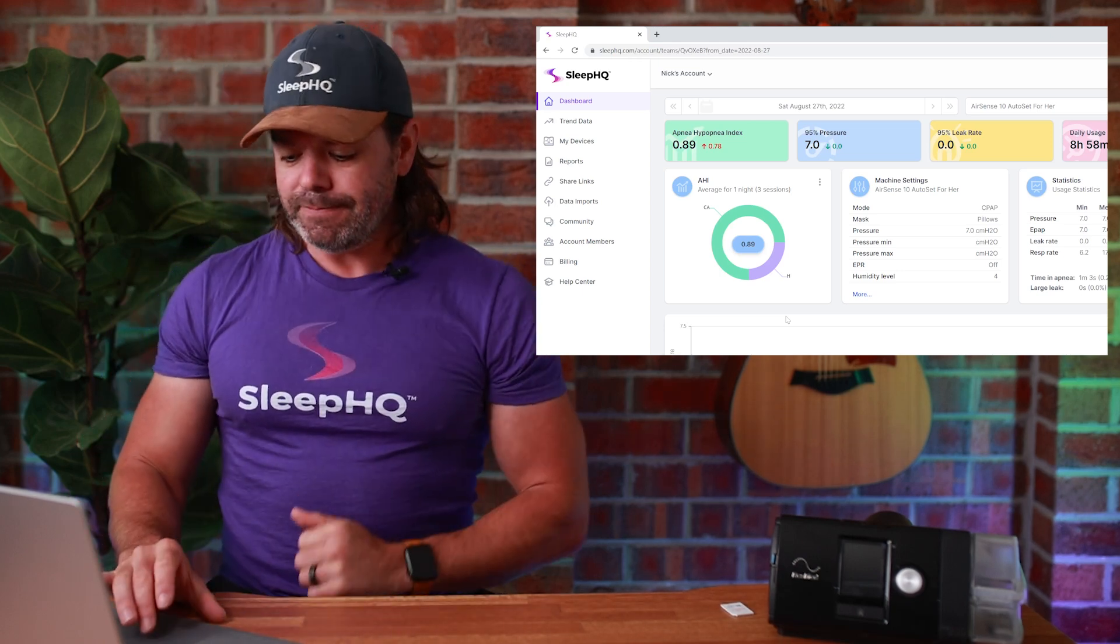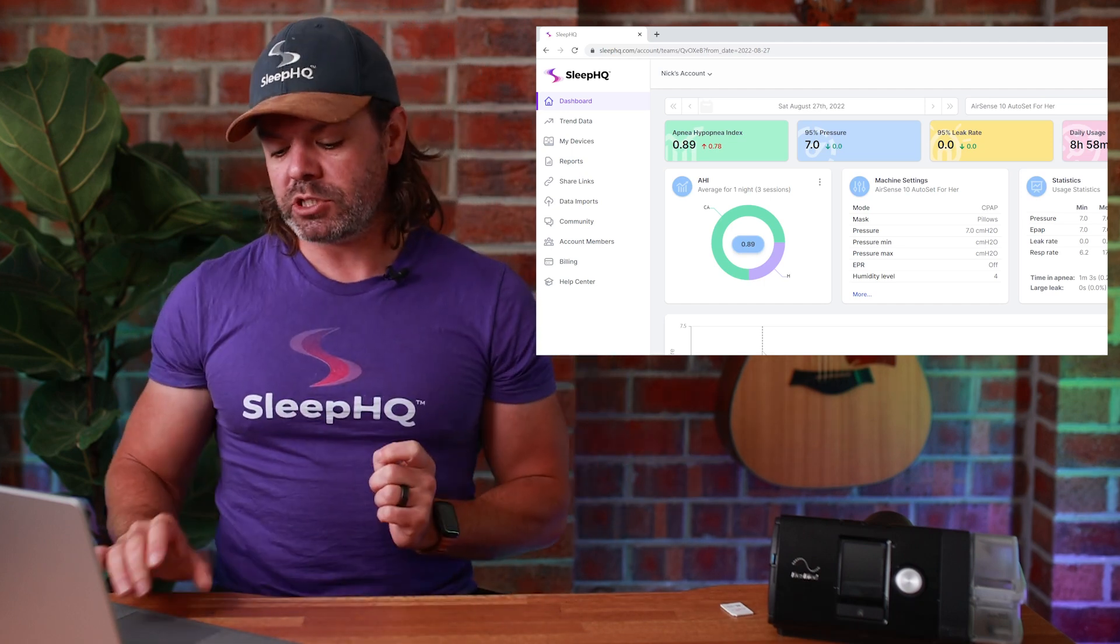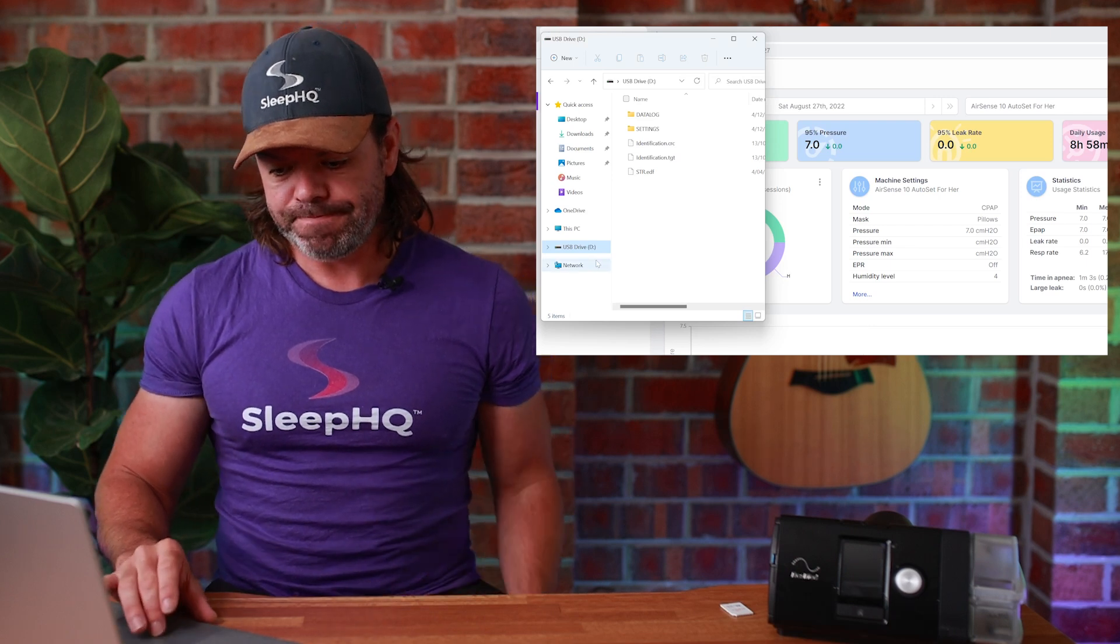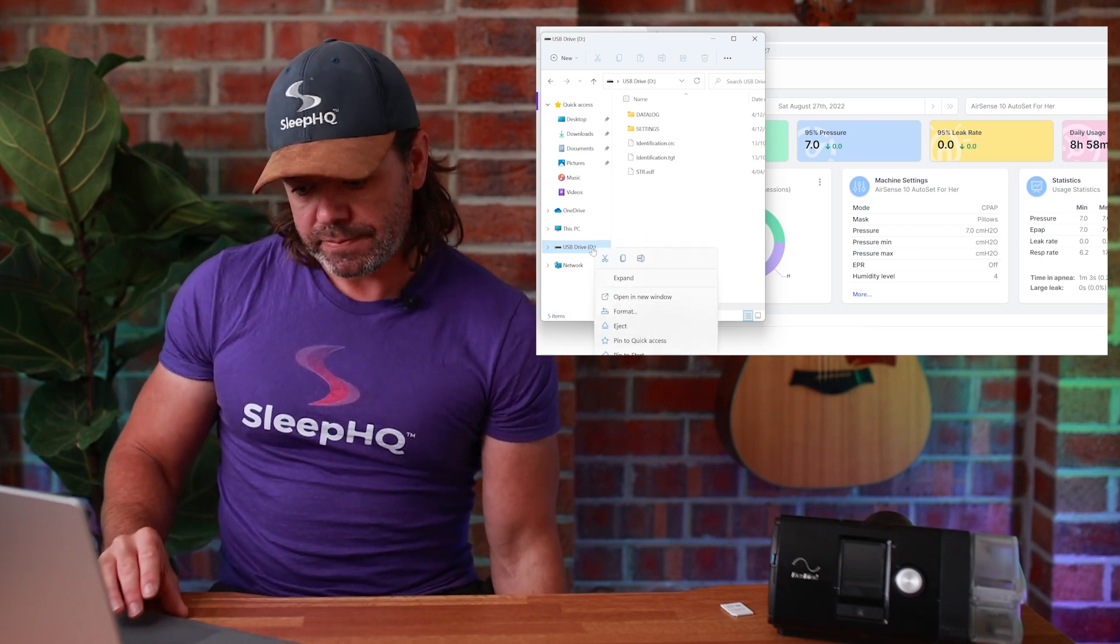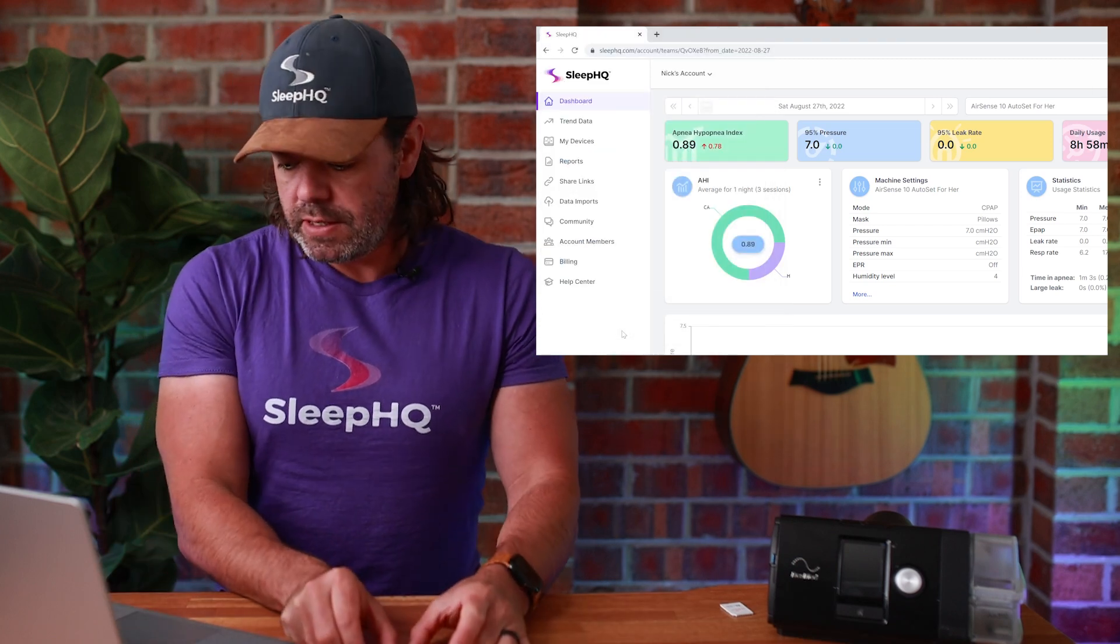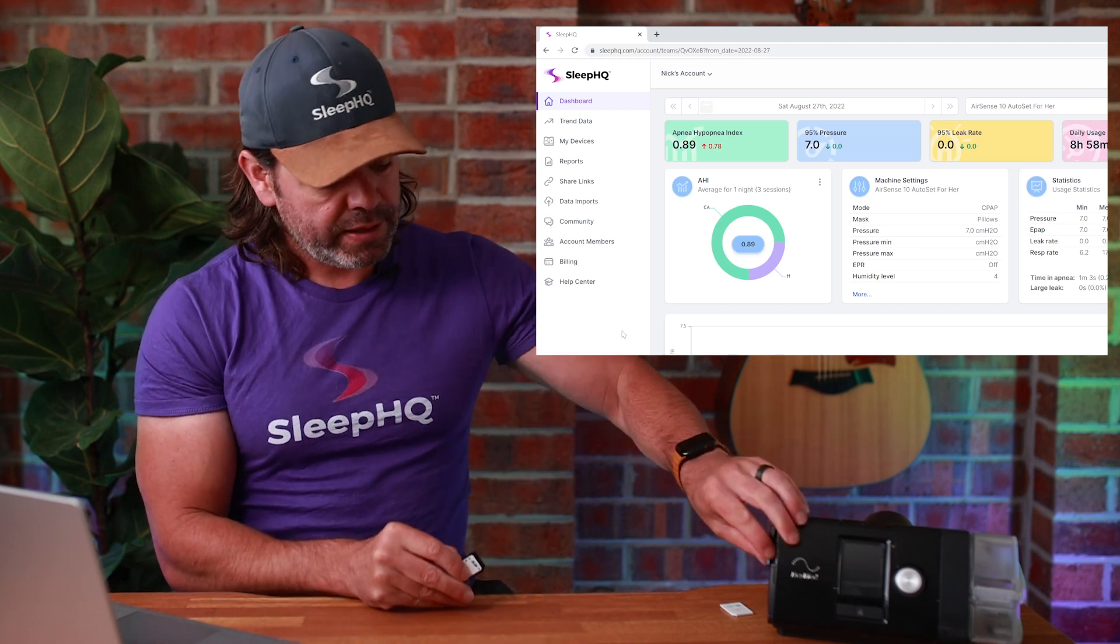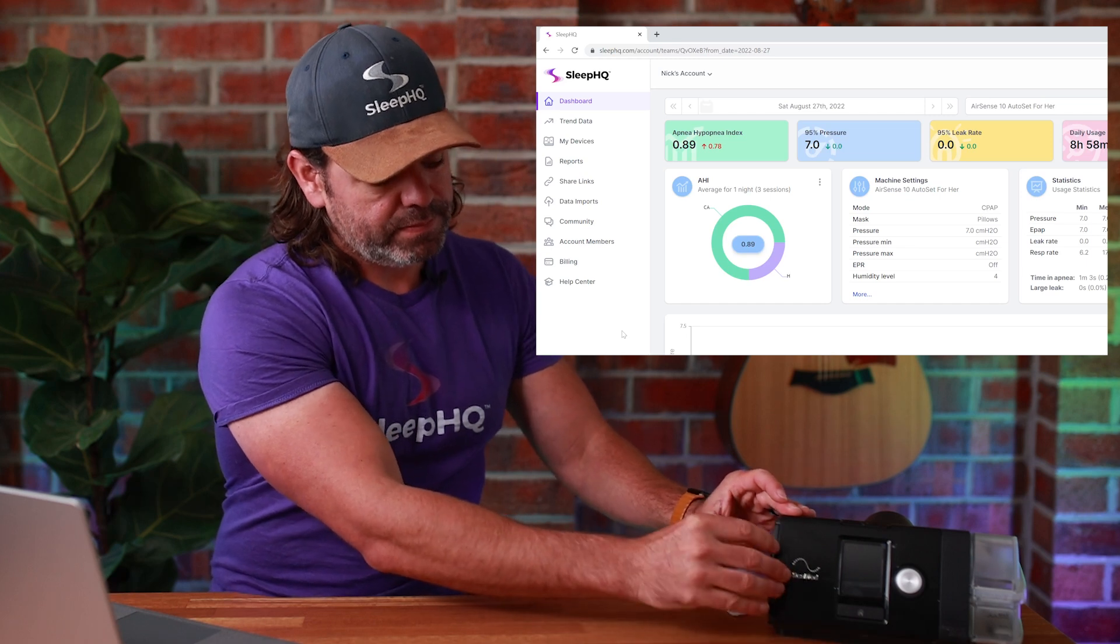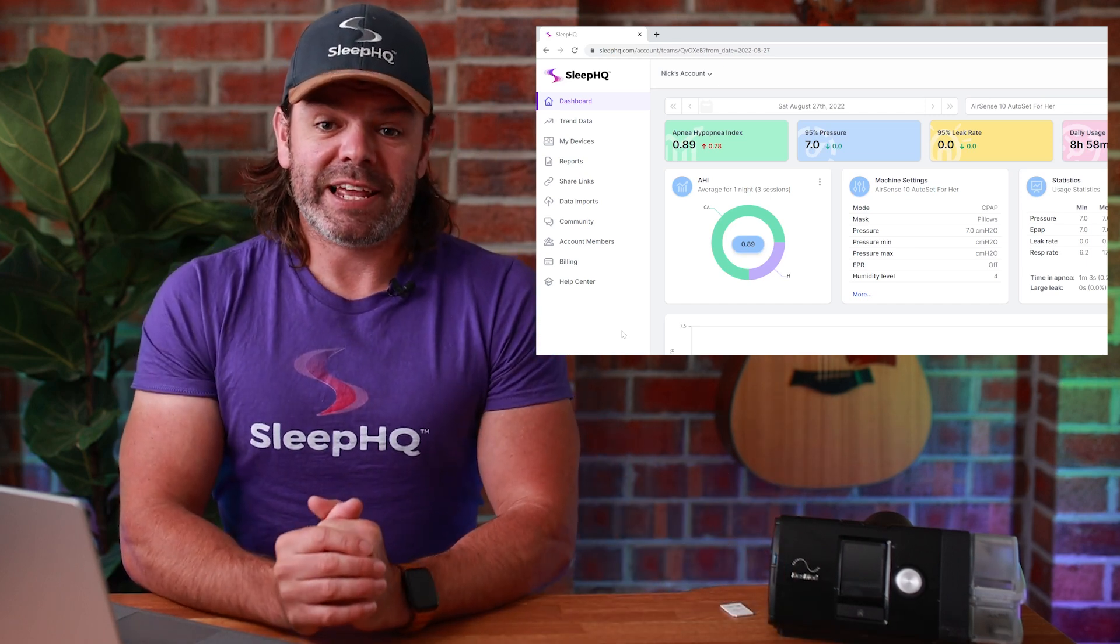Once you've done that, we need to put our SD card back into our CPAP machine. So go back to File Explorer where the SD card is. Down here where the SD card is located, right click and click eject to safely eject the SD card. Safe to remove hardware, take your SD card out and plug it back in your CPAP machine. It's that easy.